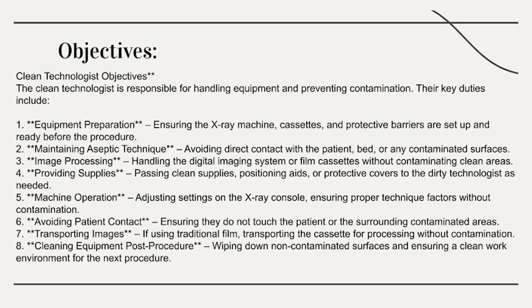Machine operation, adjusting settings on the X-ray console, ensuring proper technique factors without contamination, avoiding patient contact, ensuring they do not touch the patient or surrounding contaminated areas, transporting images. If using traditional film, transporting the cassette for processing without contamination, cleaning equipment post-procedure, wiping down non-contaminated surfaces, and ensuring a clean work environment for the next procedure.